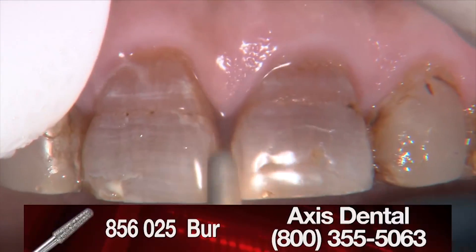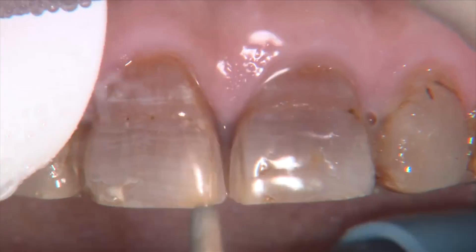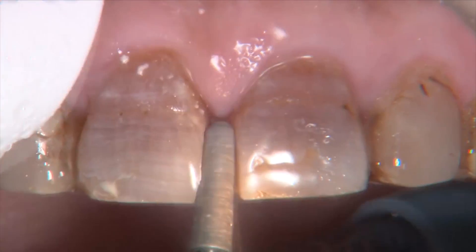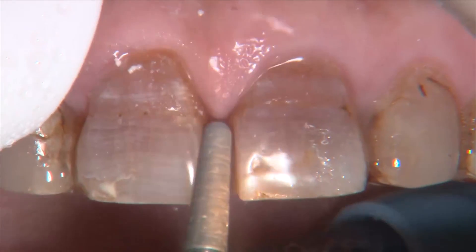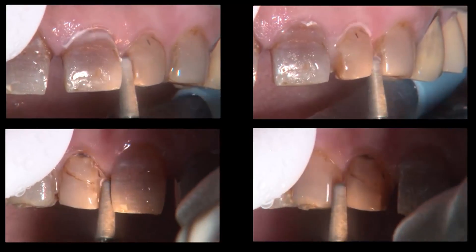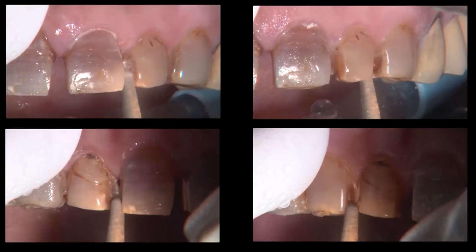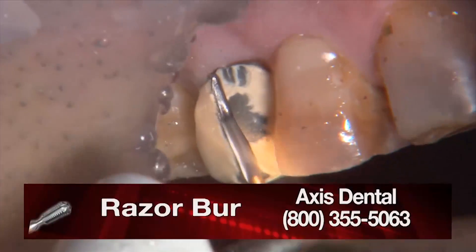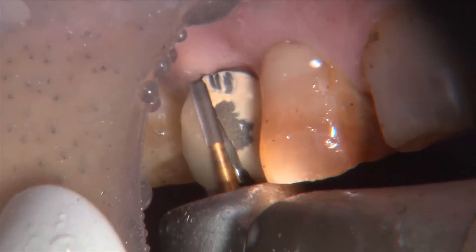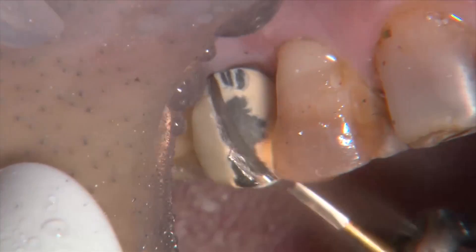We anesthetize him. Since we're prepping both these teeth, instead of breaking the contacts as the first step of the reverse preparation technique, I'm actually using the 856-025 and I'm going to break the contact, start the marginal development at the same time. This really isn't a reverse prep video, so we're going to go Brady Bunch on you and split it into screens to show you breaking all those contacts at the same time.